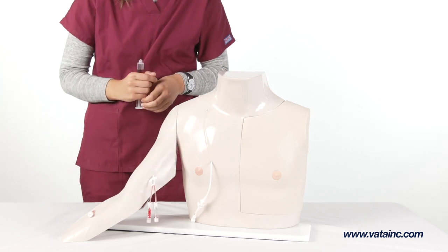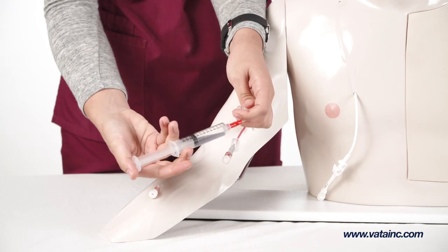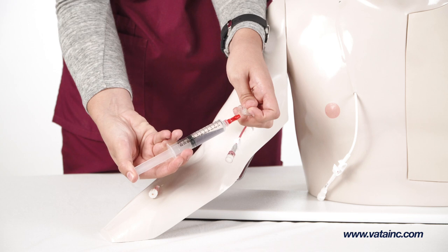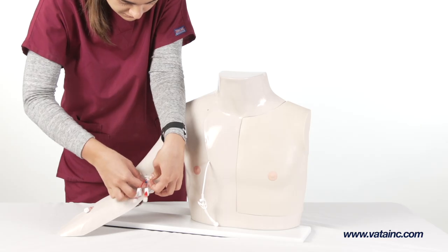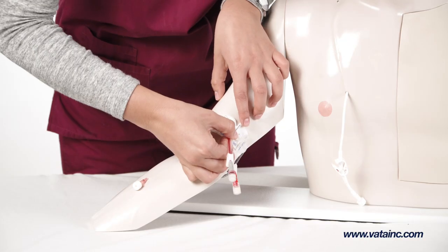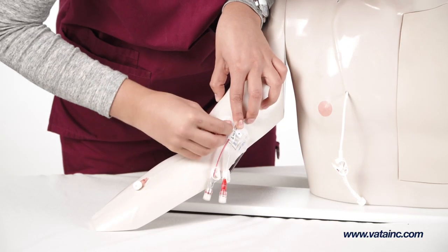The arm is now ready for use. Blood can be withdrawn and fluid infused from each line, as well as practicing the performing of dressing changes on the PICC line or peripheral IV site.